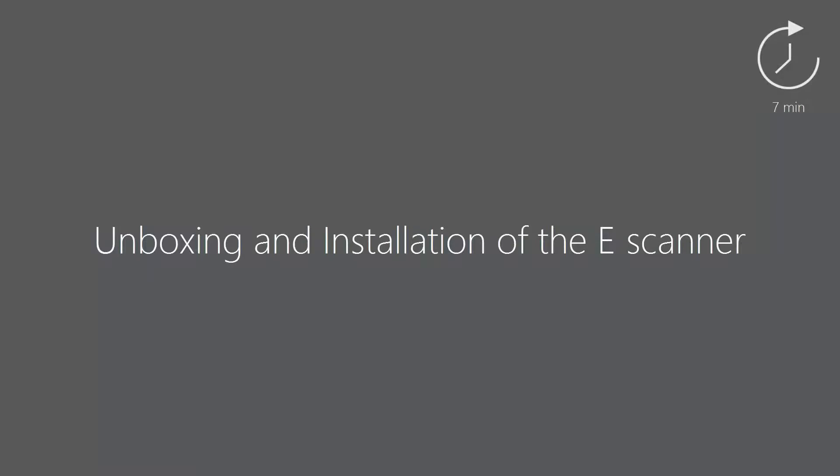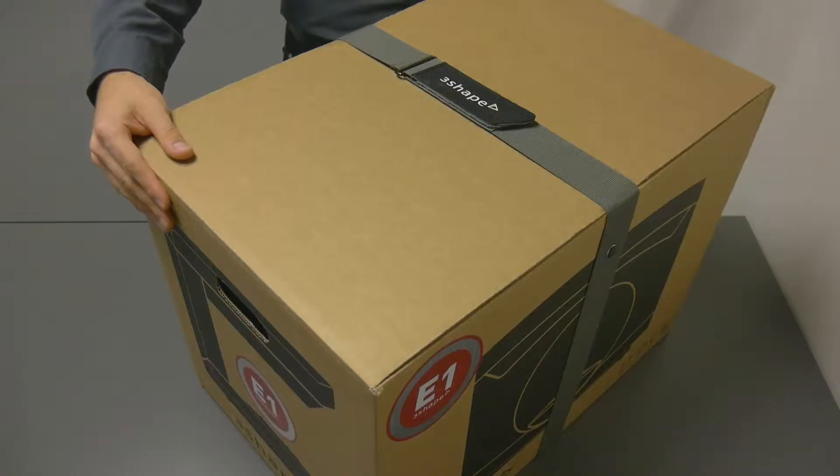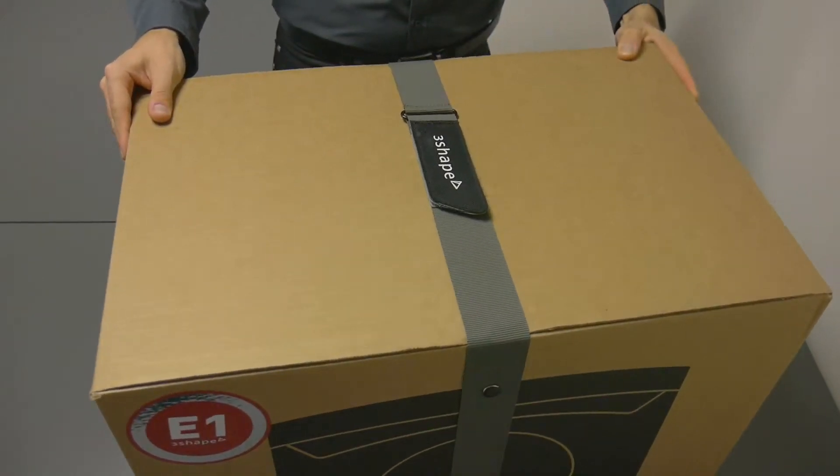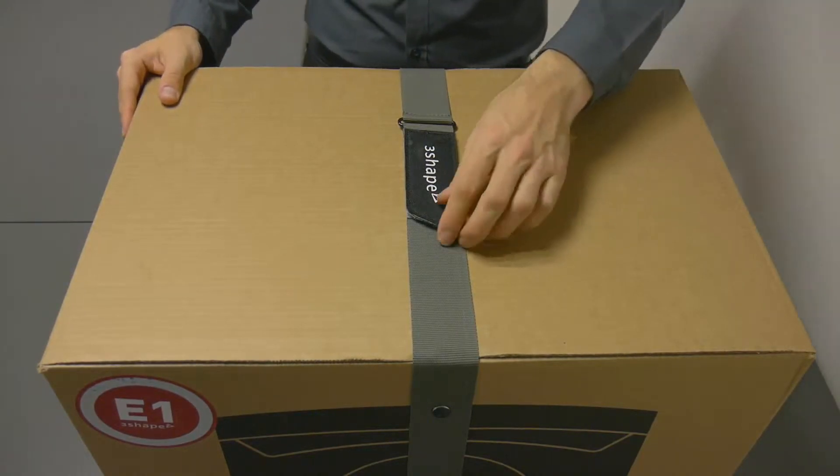Welcome to our e-scanner unboxing and installation video. E-scanners come in a taped and strapped box. In order to begin the unboxing, release the strap surrounding the box.